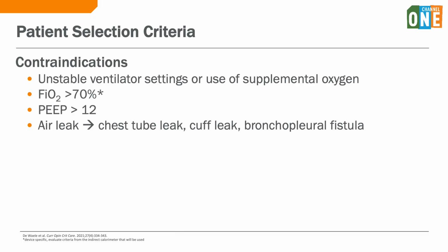Clinical care that may cause a red flag for doing indirect calorimetry tests includes suctioning a patient, extubating a patient, or the use of administered inhaled medications such as bronchodilators, or the use of nitric oxide, which can also distort readings.